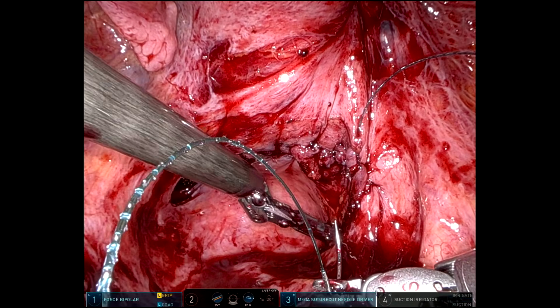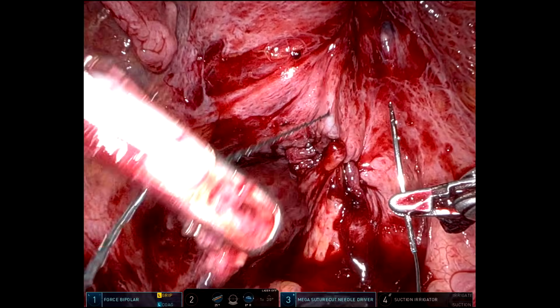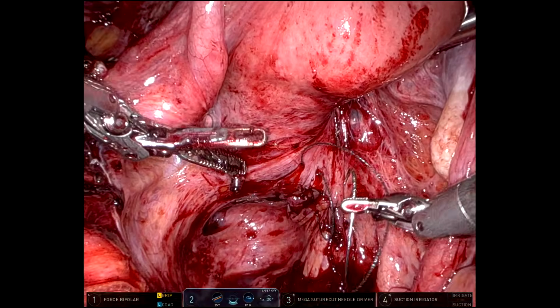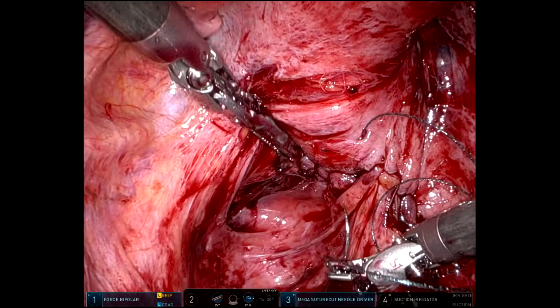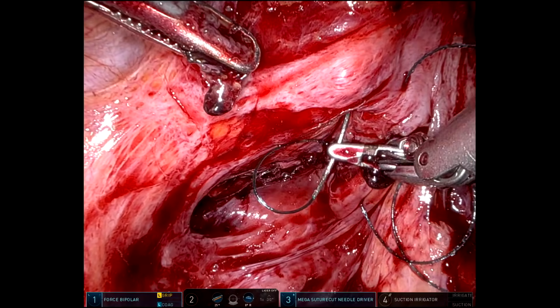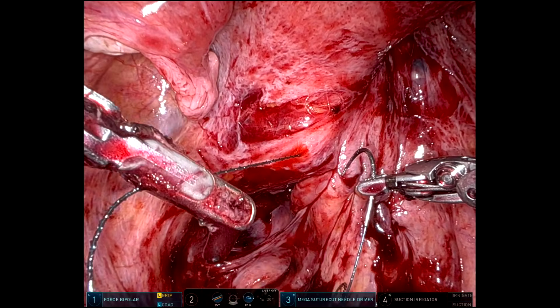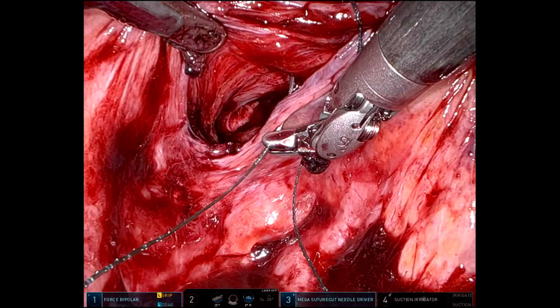And then we'll go ahead and close the peritoneum over the top. I will always try to get some tissue interposed between the vaginal suture line and the rectal suture line. I usually do that with omentum. In this case, I did mobilize an omental flap off of the right side of the transverse colon so that it reached down to the deep pelvis and separated the rectal staple line or suture line and the vaginal suture line. I'm just showing where to suture to, not to get lost and to spiral out of the way.